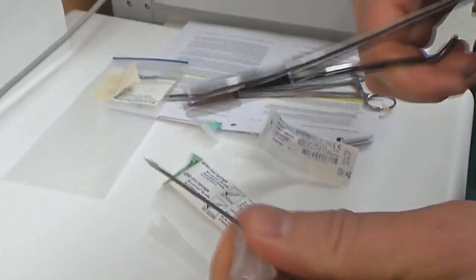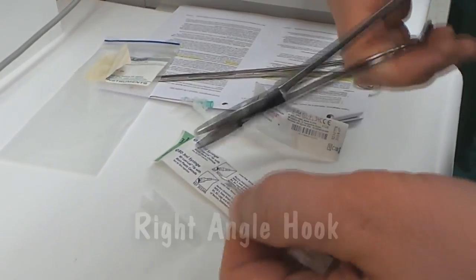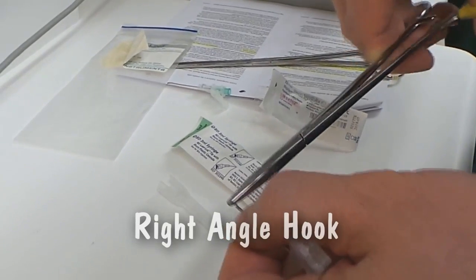So you put an eraser in both ears, right? And then the nurse at school was able to get one of them out, but we still have the one in the other ear. So we've got an 18-gauge needle. We're just going to put a little 90-degree bend in the tip, making a little bit of a hook that just might snag onto this eraser in the little guy's ears.